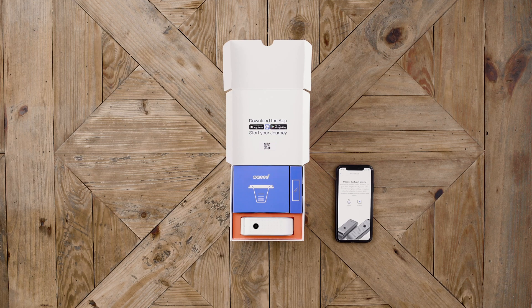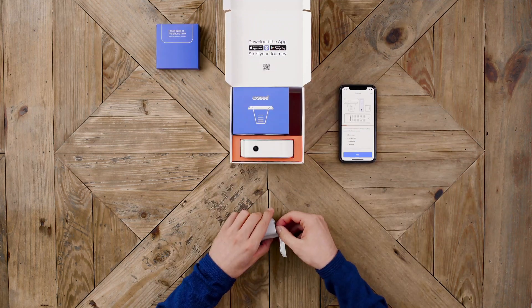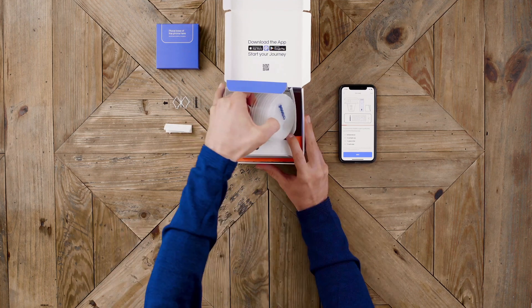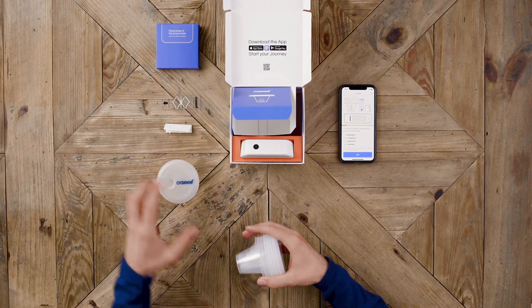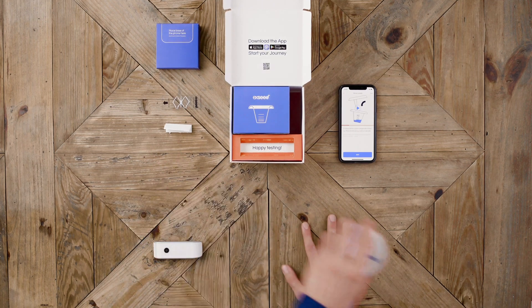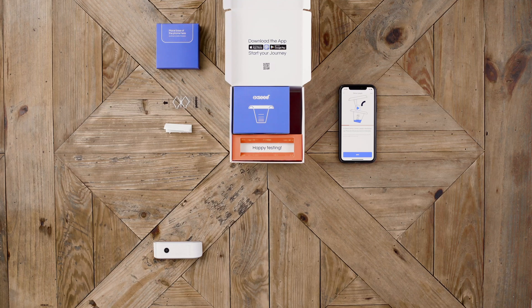You will need the following to complete a test: one glass slide, one wipe, one sample cup and lid, and the exceed device. It's time to deliver a semen sample in the exceed cup.